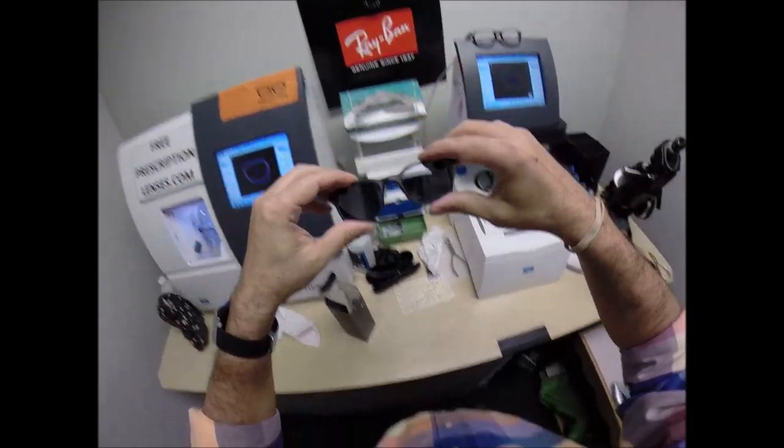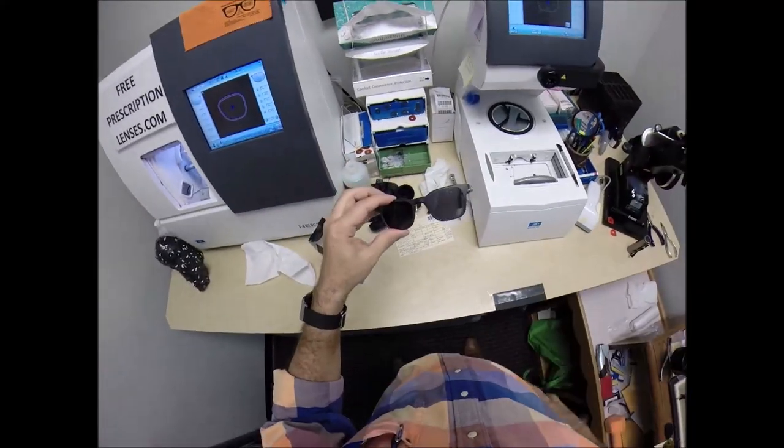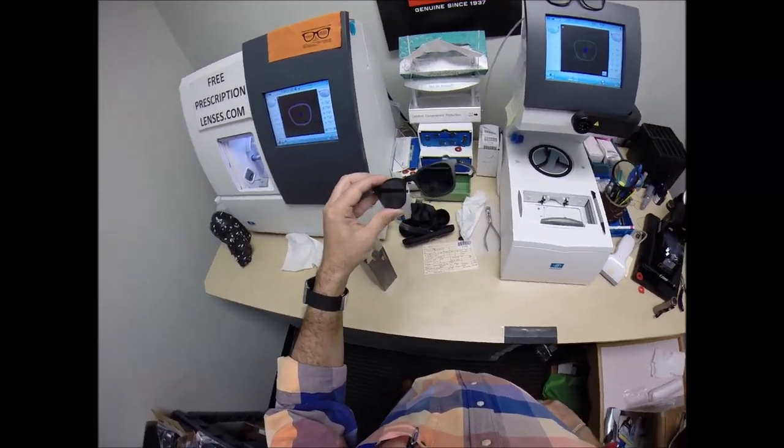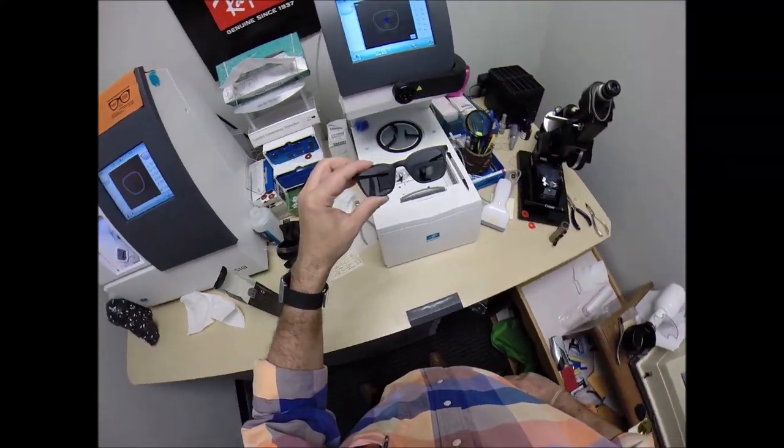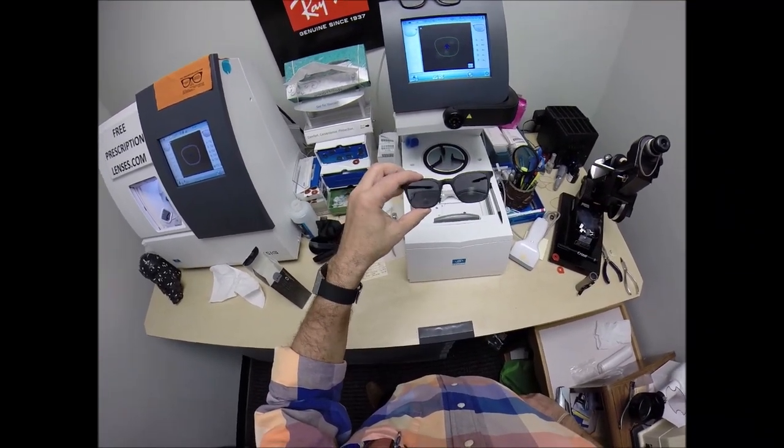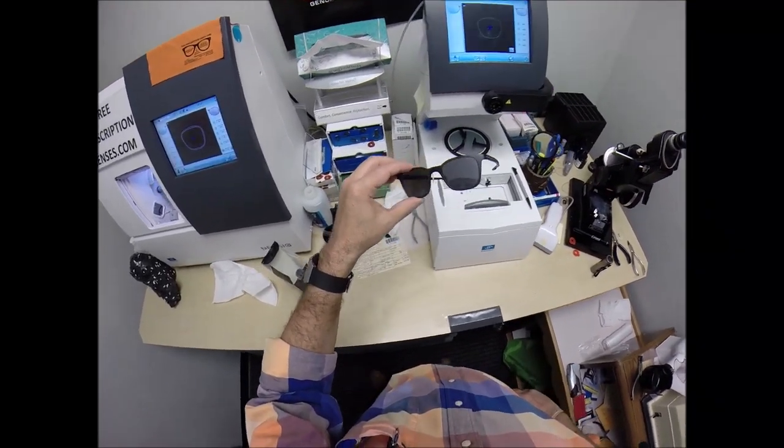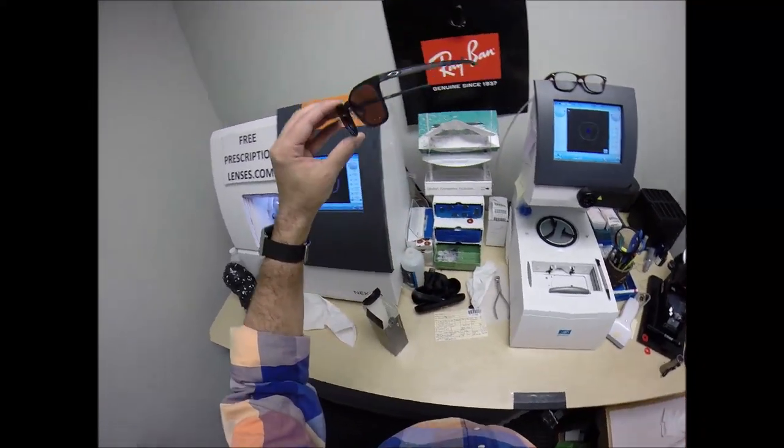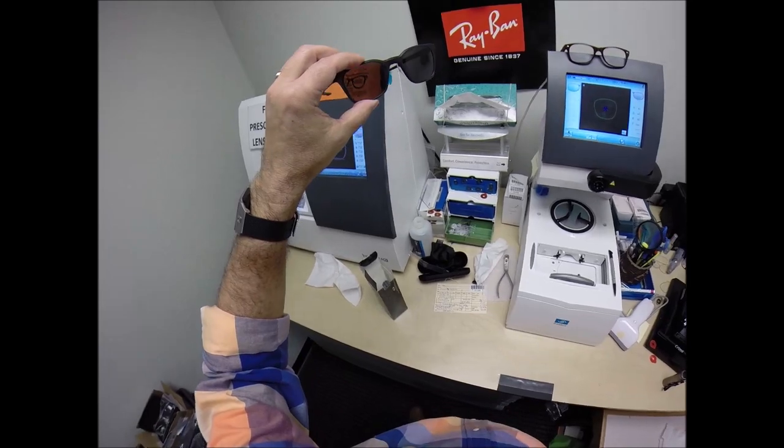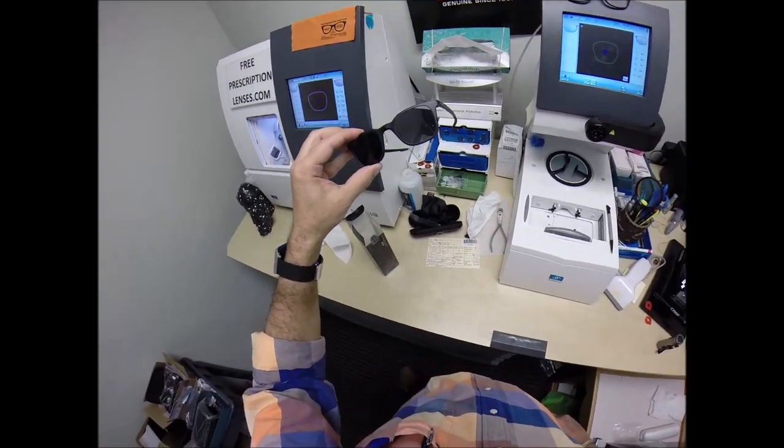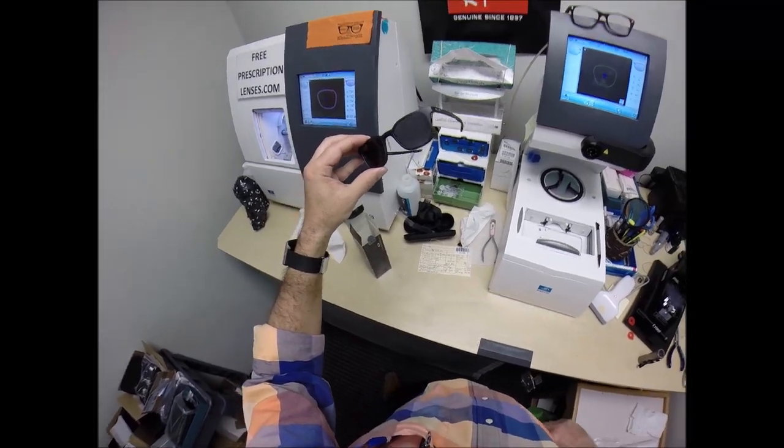But now there is the newer lens that you've been seeing a lot of in my videos called the transitions extra active. They will get 30 to 50% dark behind the windshield. They will also get darker and hotter weather for those people who live in Florida, California, Texas, anyone who is in or overseas in a hotter climates. You may want to think about the transitions extra active with being in Fargo, North Dakota. I don't think you have to worry about getting 100 degrees too many days out of the year.